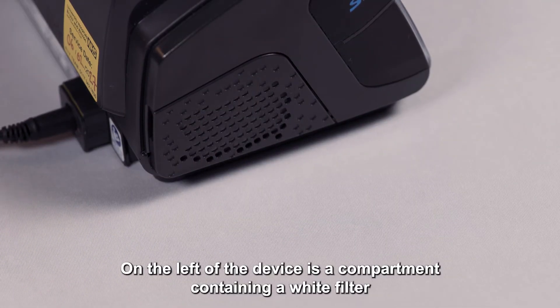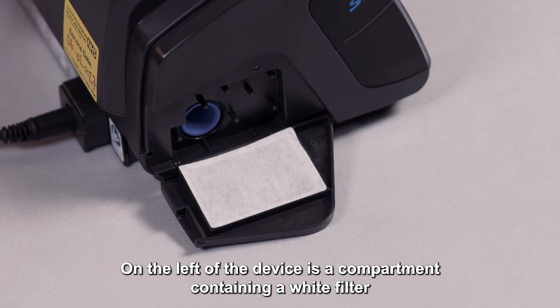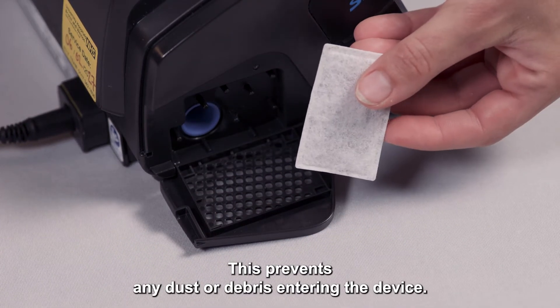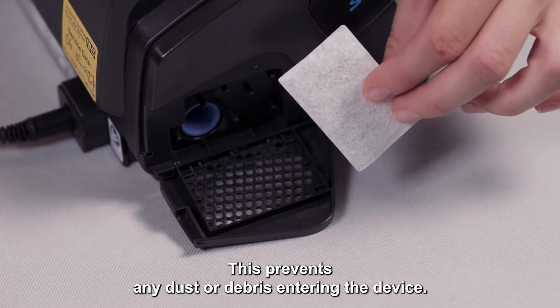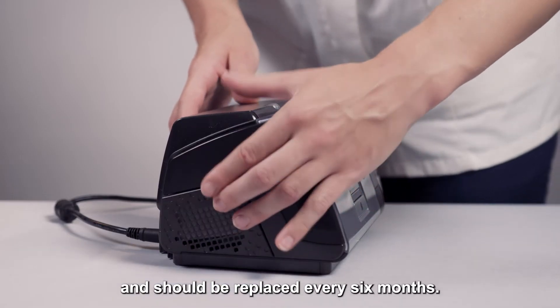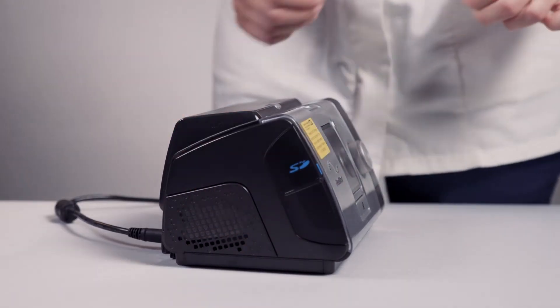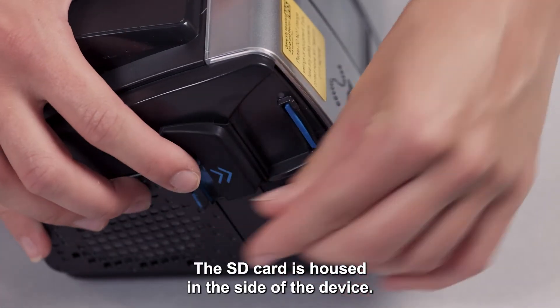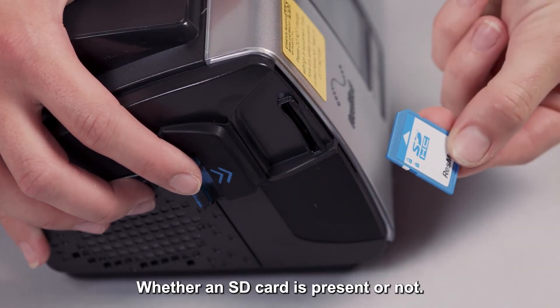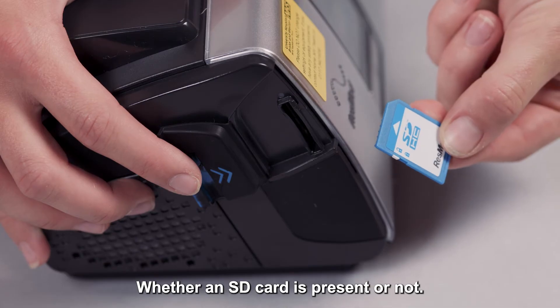On the left of the device is a compartment containing a white filter, and this should not be covered. This prevents any dust or debris entering the device. The filter is not washable or reusable and should be replaced every six months. The SD card is housed in the side of the device. The Lumis will still work normally and provide therapy whether an SD card is present or not.